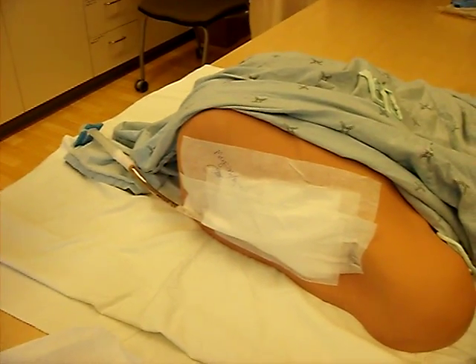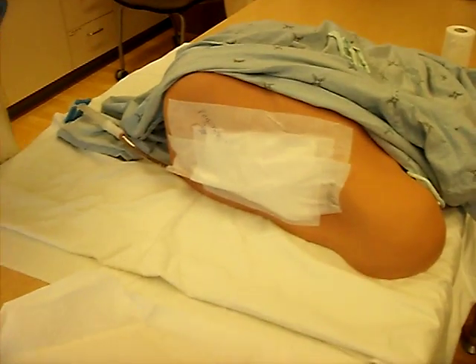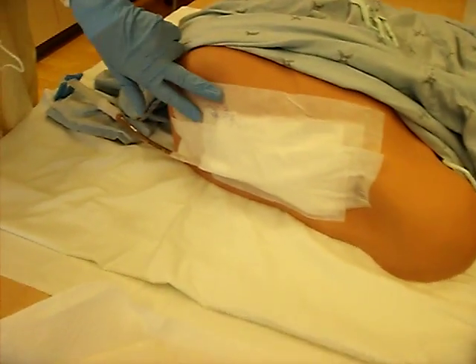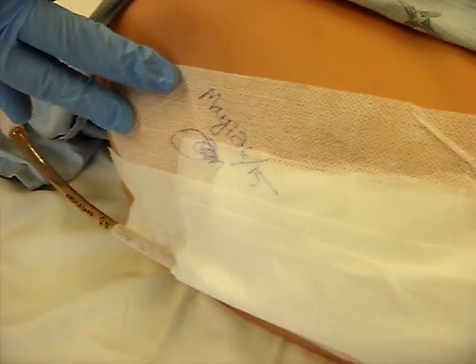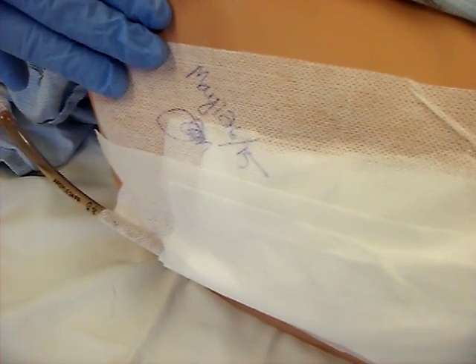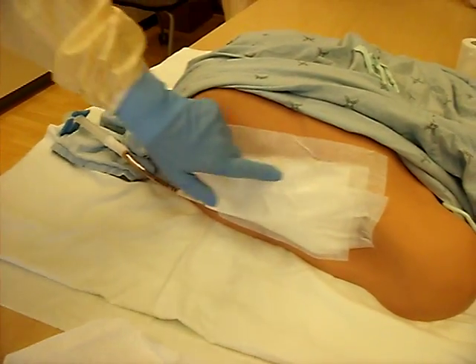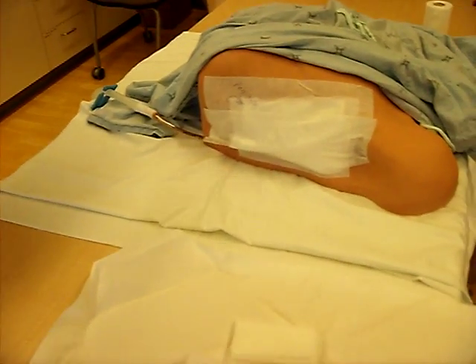So once you've done all this, you're going to have to kit up. You notice I have clean gloves on. Prior to removing the chest tube, you're going to do a dressing takedown. You'll notice that the dressing has a date on it, and that should be very clear as to when the dressing was last changed. Chest tube dressings are changed 48 hours after first putting them on, and then they're done PRN. But generally, every couple of days you should be taking that down because they can get kind of wet and mucky around the site. It's pretty moist under there.